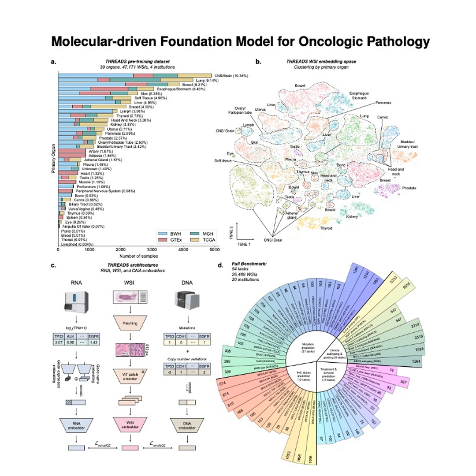Right. Paired data. Exactly. So when the AI is training, it takes a slide image from, say, patient X, and it also takes the molecular profile from patient X. Then the AI tries to make the visual representation it generates for that slide look mathematically more similar to patient X's molecular profile than it does to any other patient's molecular profile, like patient Y or patient Z.